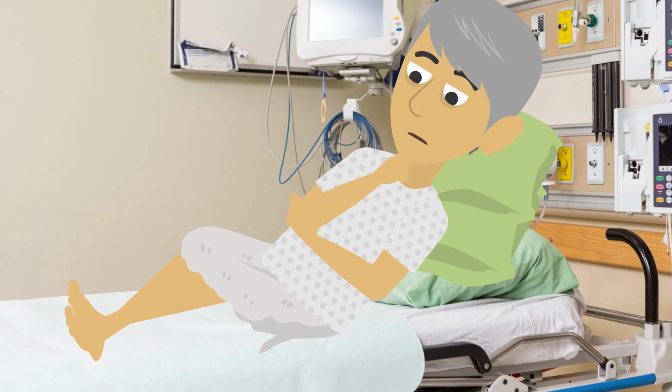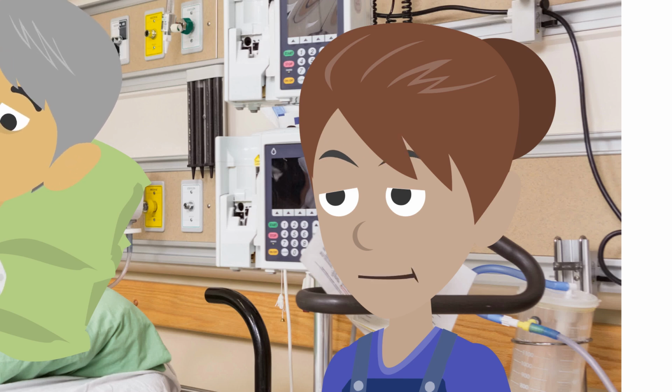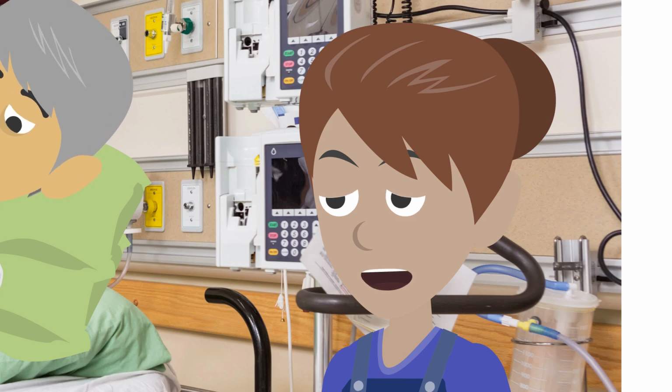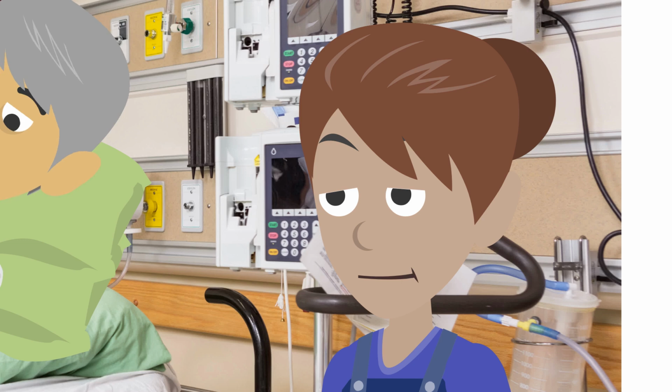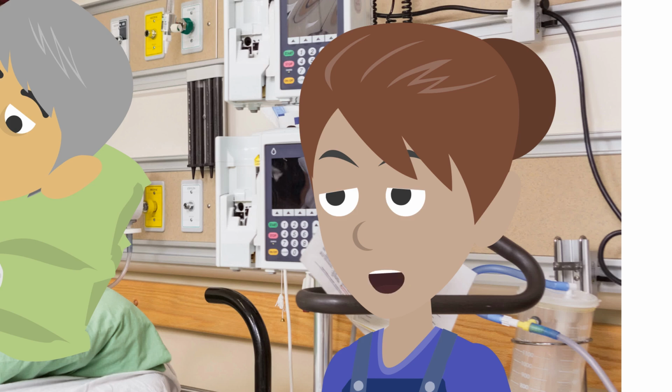Okay. You're doing very well. I can see that the measurement marking has reached the entrance to your nostril, so I'm not going to insert the tube any further. I'm going to secure the tube to your nose and your cheek now, so the tube remains in place.